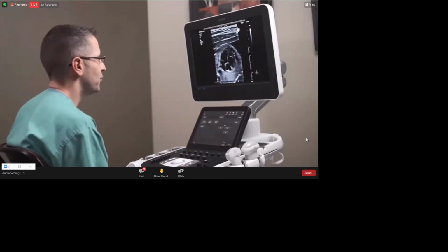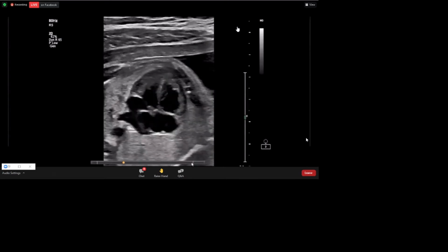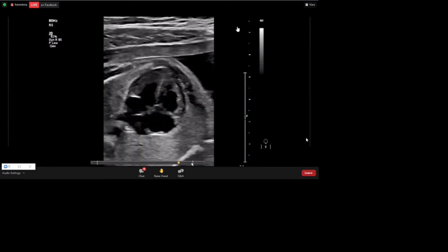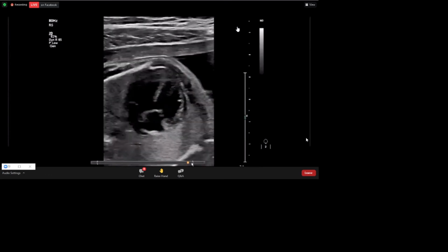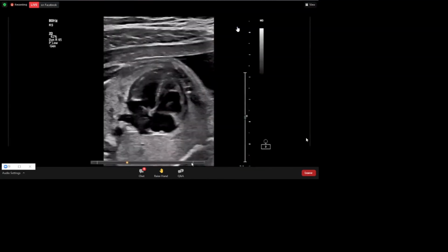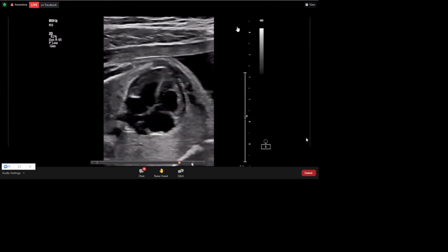What you can see in this image, which often is difficult to see, is a near field, far field contrast of the cardiac silhouette. What I'm impressed with is the ability to see the myocardium in discrete contrast from the pericardial sac. You can easily see the actual foramen ovale opening and closing. The atrioventricular valves, we have the tricuspid and mitral valve here that look beautiful, and the interventricular septum, moderator band is demonstrated to us, and overall just an absolute crisp design and representation of the fetal cardiac structure.